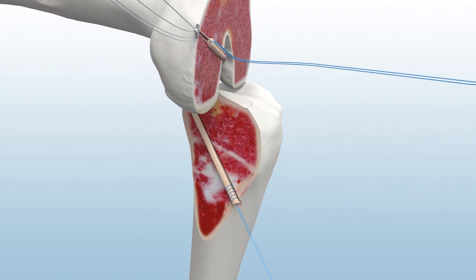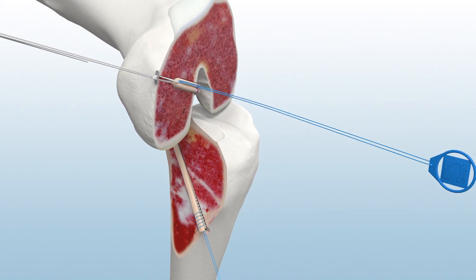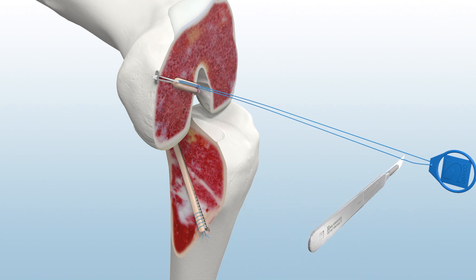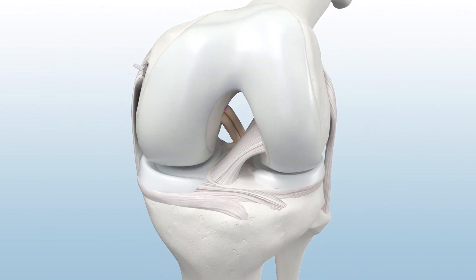For tibial fixation, cycle the knee and fixate with a Genesis Matrix Interference Screw with the knee at 90 degrees of flexion. Finally, remove the lead suture and cut the femoral button's suture limbs at the skin, taking care not to cut the friction lock. Then, trim any excess tibial graft limbs and cut one of the reversible button tab sutures to complete the reconstruction.